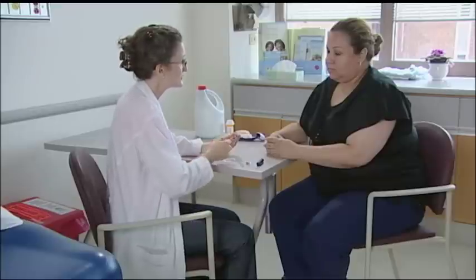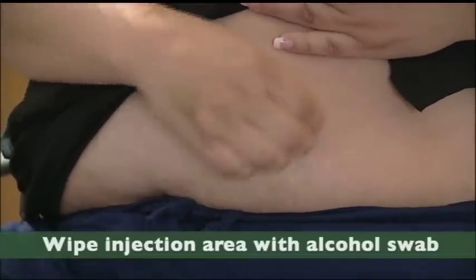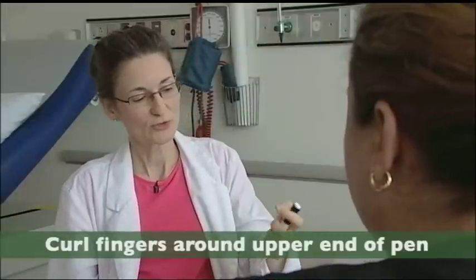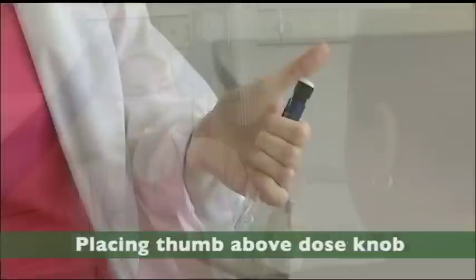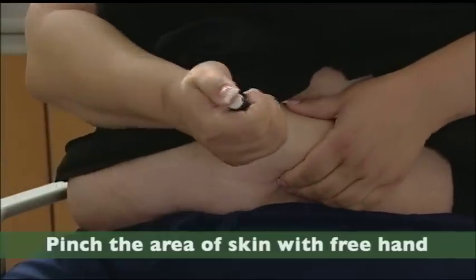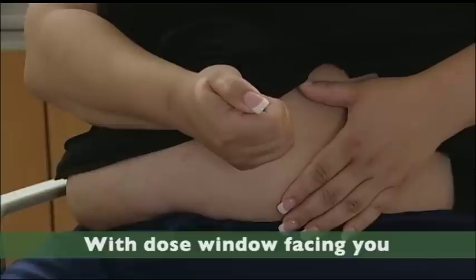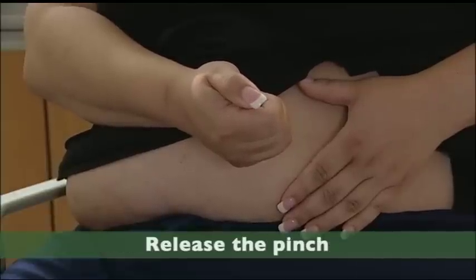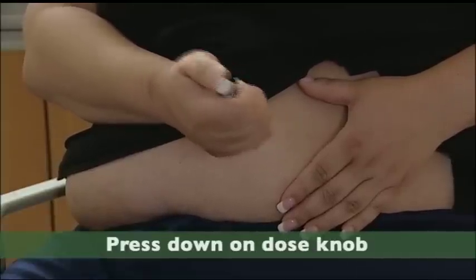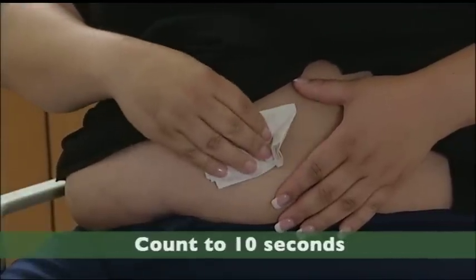Wipe the area with your alcohol swab. Curl your fingers around the upper part of the pen, keeping your thumb above the dose knob. Pinch the area you're going to inject into and go straight in at a 90-degree angle with the dose window facing you. Release your pinch, press down on the dose knob, and when it goes back to zero, count to ten seconds, then pull it straight out.